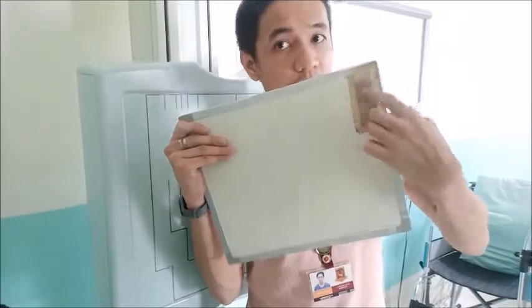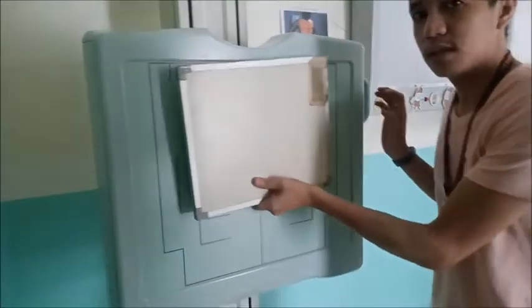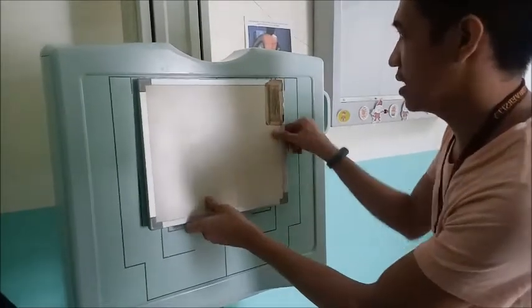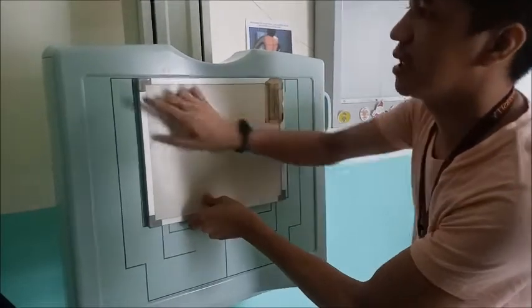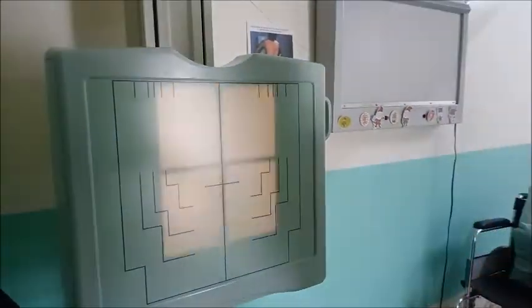This is my right side. This is the right side of the cassette. So dapat tingnan na ang ihang position pag sulod na ko diri sa cassette. Right side. So the size of the cassette, this is the center of our cassette. Almost at the 14, the line before the 14.